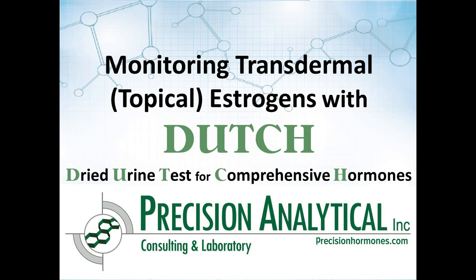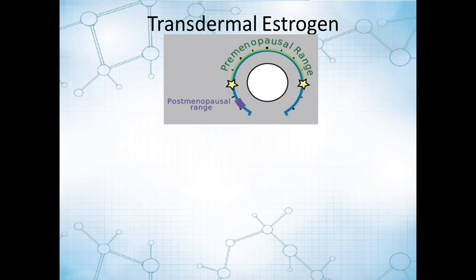This video is to assist you with the interpretation of your results for patients using the Dutch testing model that are taking estrogens transdermally, or on their skin, in predominantly a cream. Just as a reminder, as we look at these results on page 2 of the report, the results when they come between these two stars find themselves in the premenopausal range, whereas the little purple band at the bottom there represents the postmenopausal range.